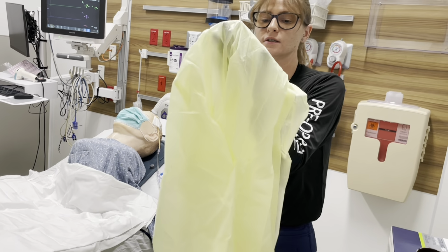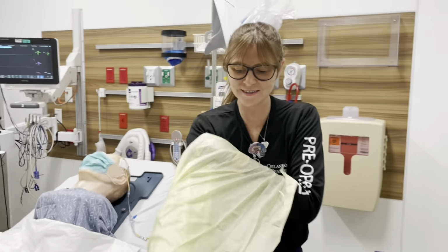You're gonna cut this so that way I just go into the gown? Yeah, if your gown wasn't all inside out.